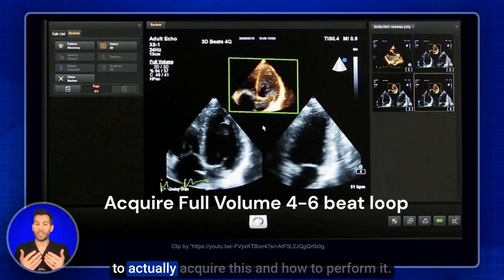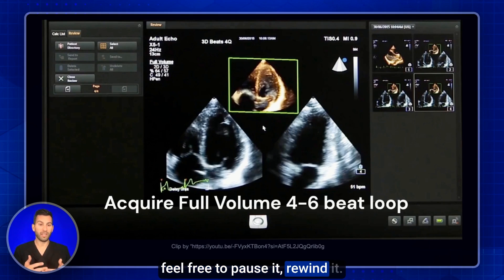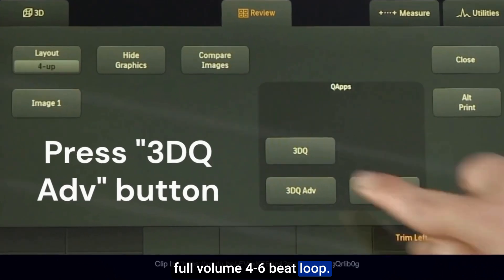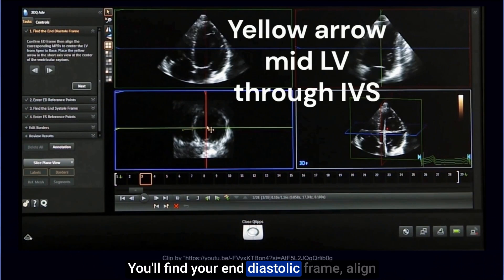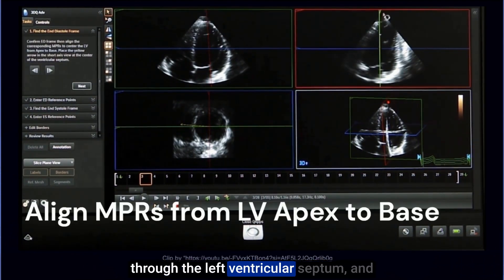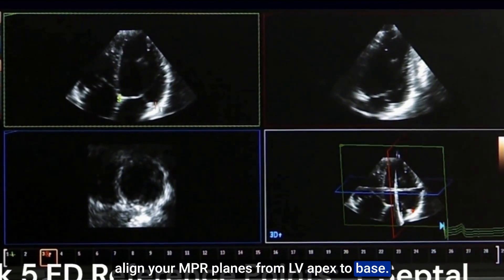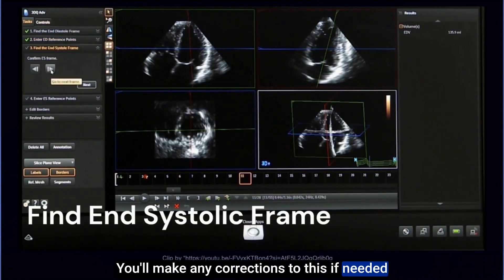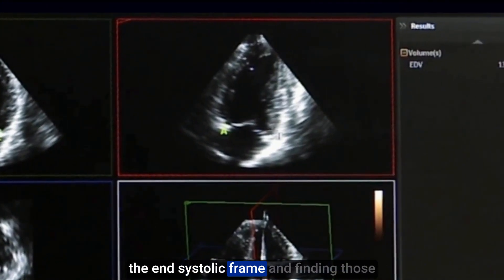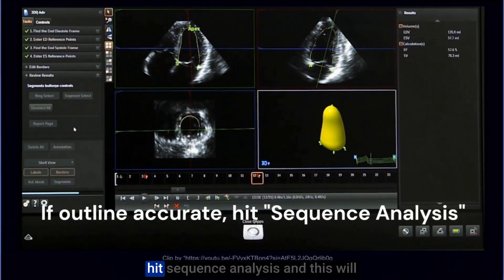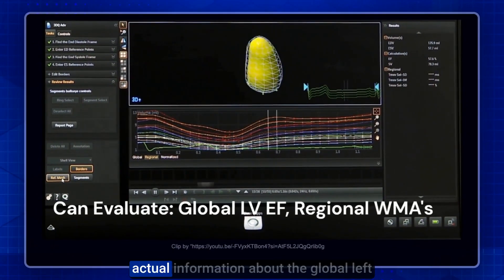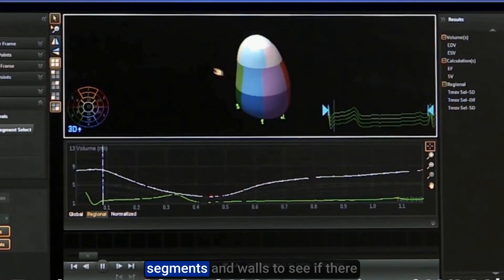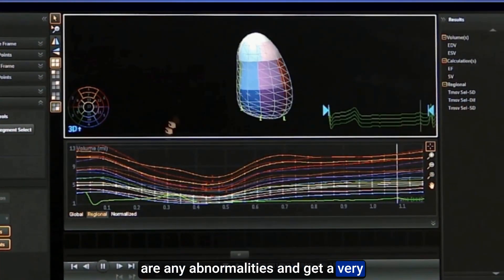Here's a walkthrough of how to perform 3D quantification on a Philips system — feel free to pause or rewind. Start by acquiring a full volume 4-to-6-beat loop, then press the 3D QA or Advantage button. Find your end diastolic frame, align the yellow arrow through the mid-LV septum, and align your MPR planes from LV apex to base. Place five reference points marking the mitral annulus and apex of the LV to produce an LV outline, make any corrections, then repeat for the end systolic frame. Hit sequence analysis to get the global LV ejection fraction and specific regional wall motion abnormalities by segment.